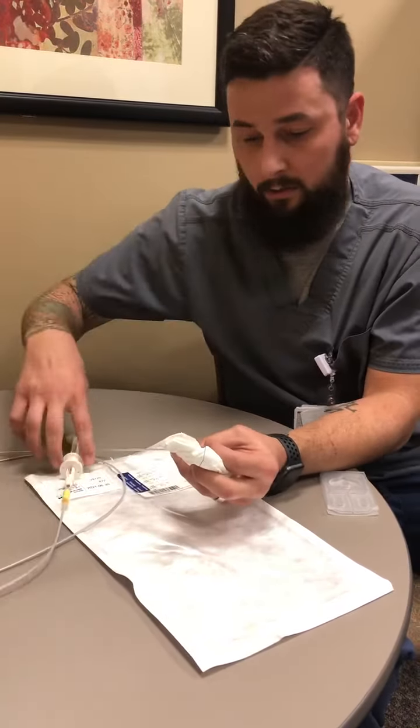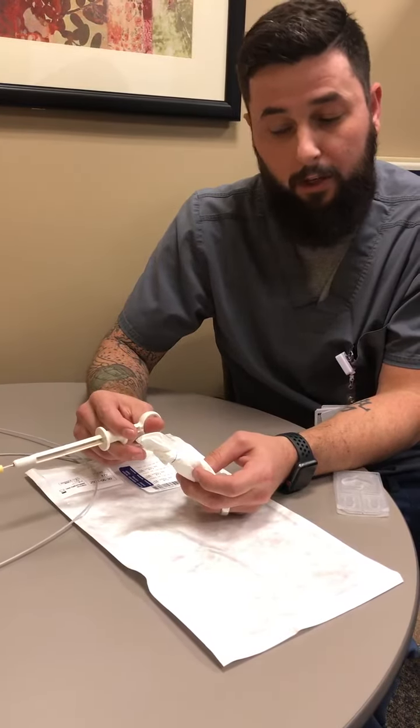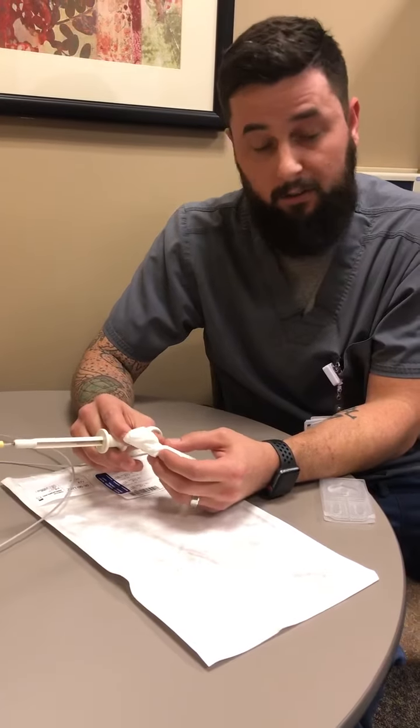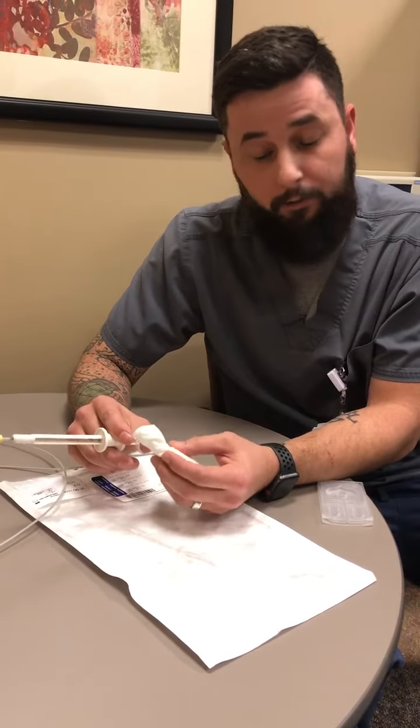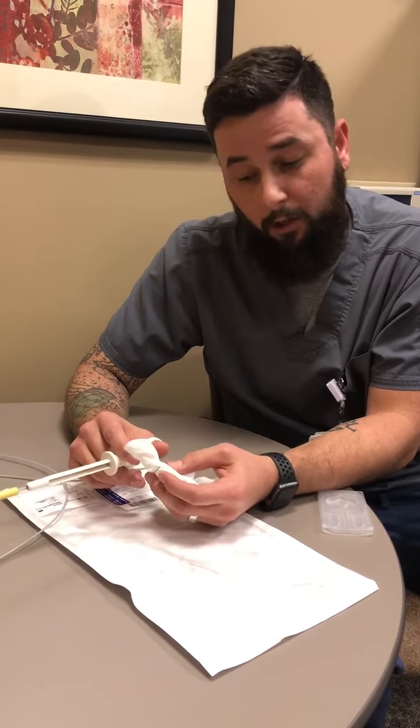You will slowly start using your handle to close — tighten, tighten, tighten — all the way up until you get some blanching of the tissue. It might not go all the way up on the handle, or it might — it depends on the size of the stalk. You're feeling for a good amount of resistance. You don't want to go too far as to cut the stalk of the polyp.